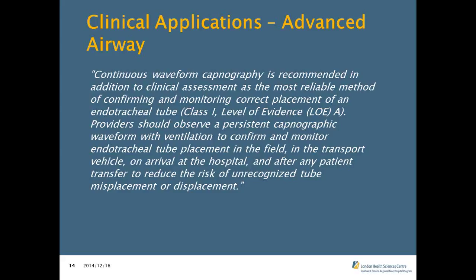It should be used with a King LT as well. It hasn't been studied or confirmed, but the direct wording they use is that effective ventilation through a supraglottic airway device should result in a capnographic waveform during CPR and with a ROSC.